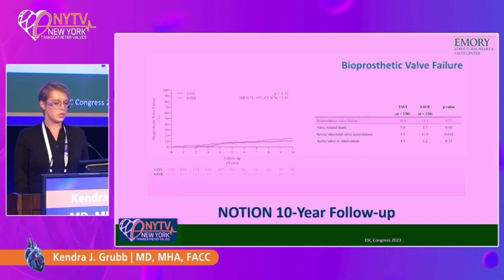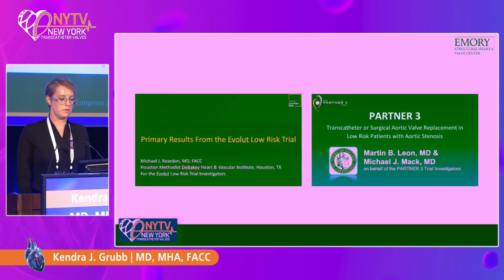Importantly, in this NOTION study, the bioprosthetic valve failure based on reintervention, death, severe structural valve deterioration, or aortic valve reintervention, which I already mentioned, was no different. So maybe TAVR is the right choice. Certainly, this durability data suggests there was no difference.